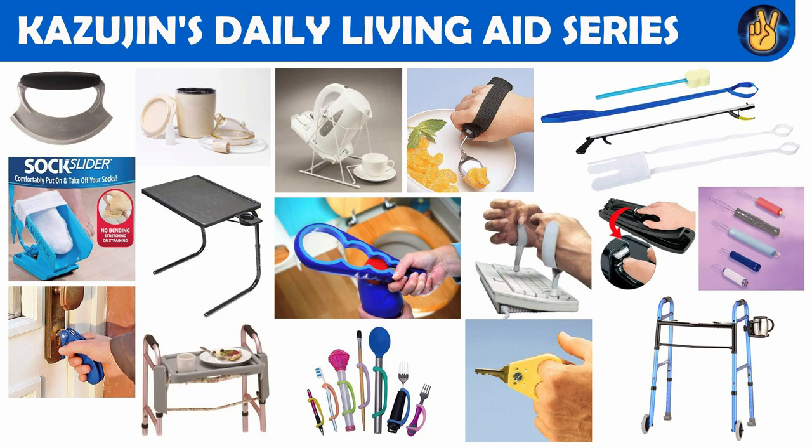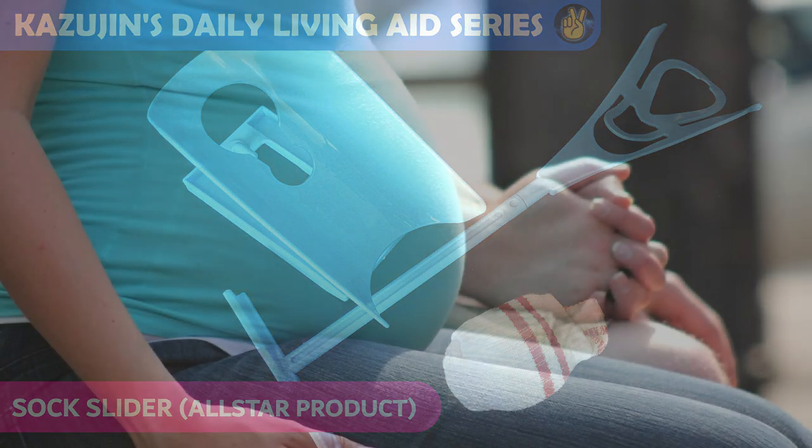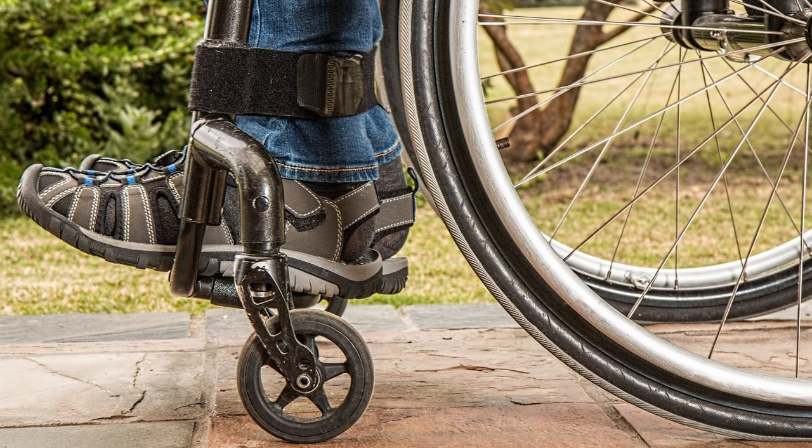Today's video, we have yet another exciting product to review here, namely the Sock Slider by Allstar. The Sock Slider is a sock wearing aid designed specifically for those with pregnancy, limited mobility and injury which prevents them from bending downwards or folding their legs entirely.